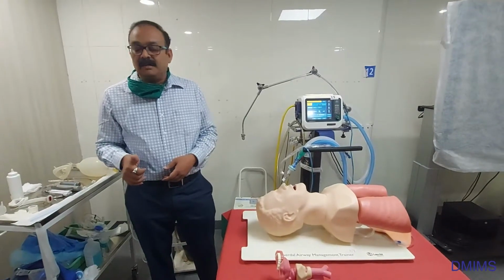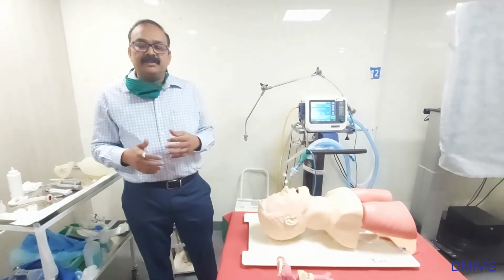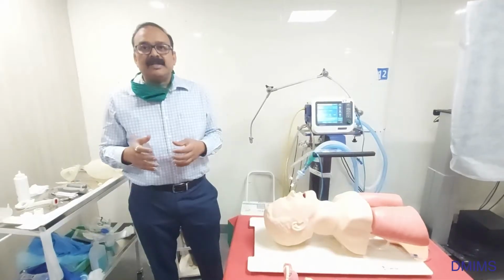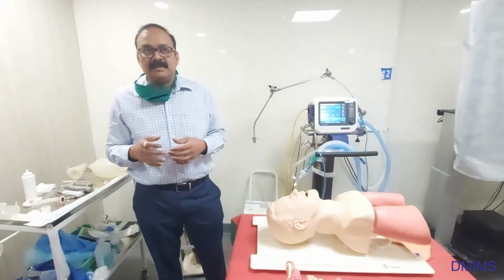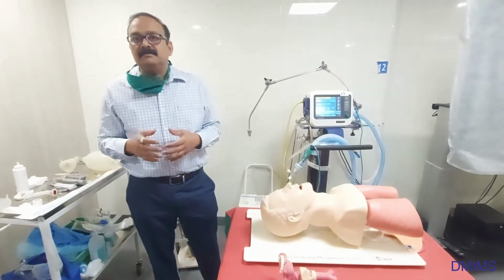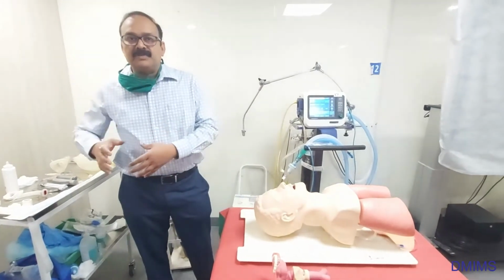Today we will see about the technique of intubation. So what is intubation and when do we have to do it? Intubation means we have to achieve protection of the airway by inserting a tube, called an endotracheal tube, into the trachea of the patient. It can be done in emergency or in elective situations.